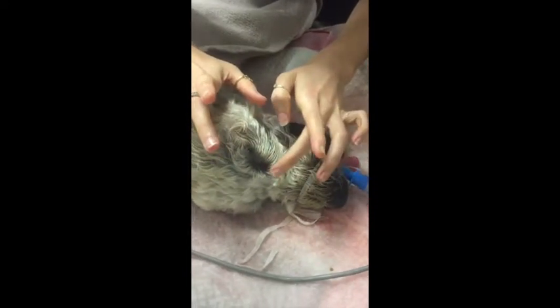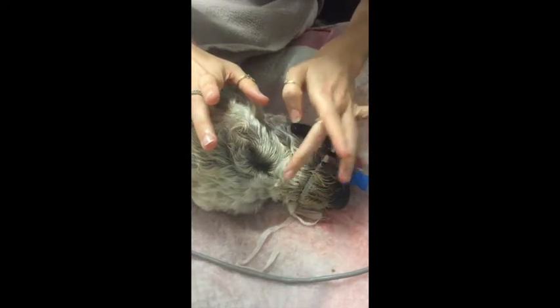A palpebral reflex becomes slow, and when tapped there is either little to no response when under a surgical plane of anaesthesia. As you can see for this patient, there is little to no palpebral reflex, which means they are in a good plane of surgical anaesthesia, but as there is no response at all, it's important to be aware that we don't want the anaesthetic depth to increase further beyond this.